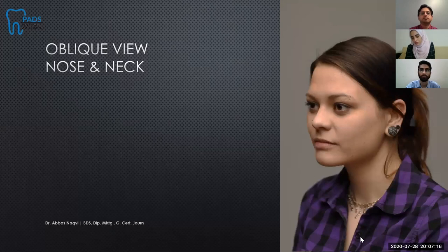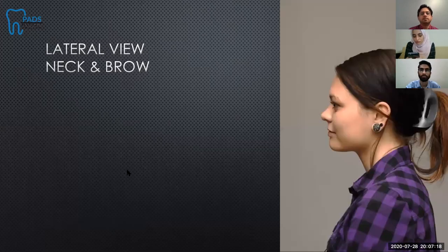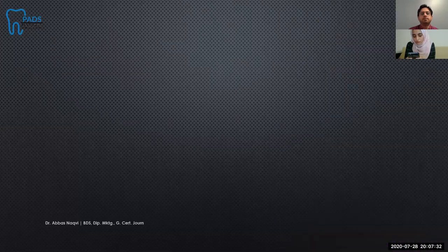So, probably one of the most straightforward images to take. But just make sure you pull the retractors out of the view. The retractors should ideally not come into the view. Or if they do, you can crop them out, but ideally you should not get them. Keep your angle of views as consistent as possible, as they reflect the progress of this patient throughout these months.